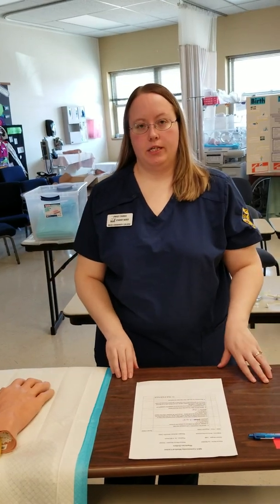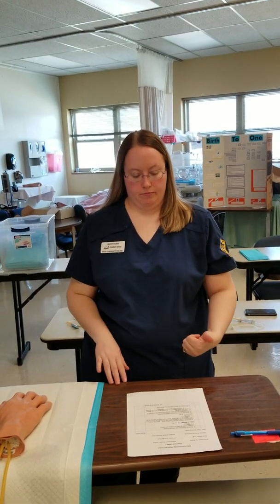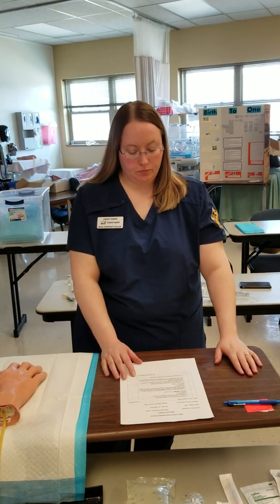Thomas, and I'm going to be doing the return for the peripheral IV infusion. For starters, I would follow the 6 rights of medication administration, which is right patient, right medication, right dose, right route, right time, and right documentation. I would then go ahead and check the physician orders with the MAR.